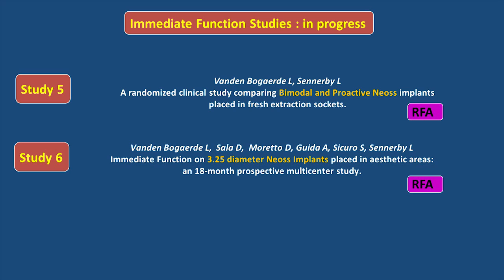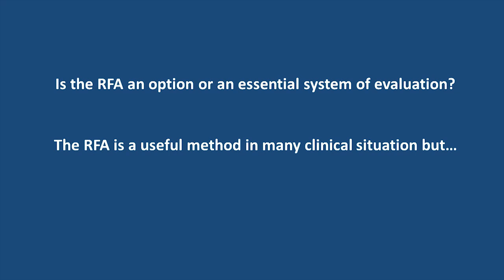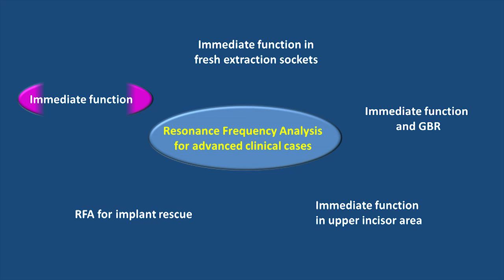The question is, is the RFA an option or an essential system of the evaluation? In my opinion, the RFA is a useful method in many clinical situations. But there is some clinical condition where the RFA is essential for the success of the therapy. And I try to identify this condition, the immediate function.